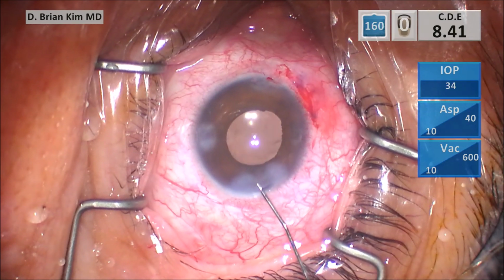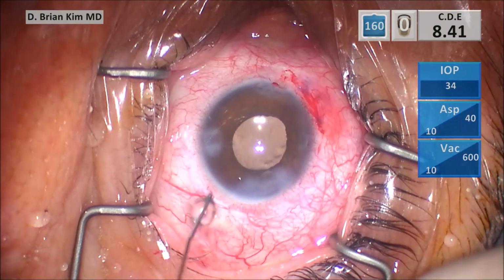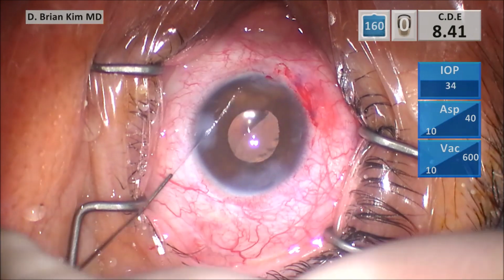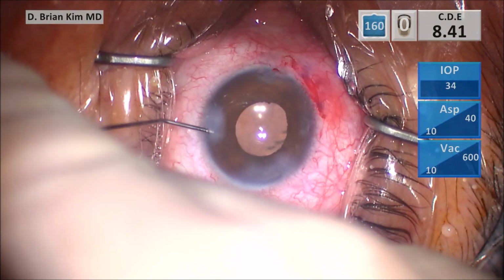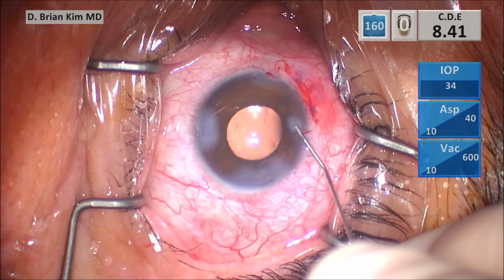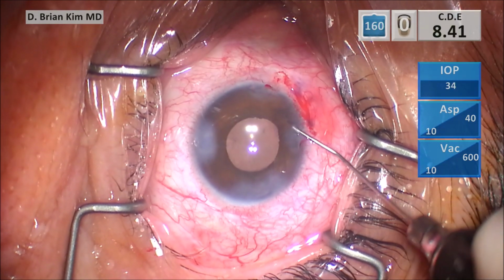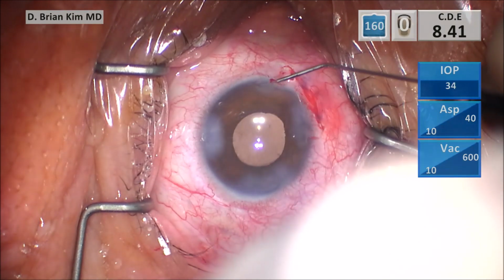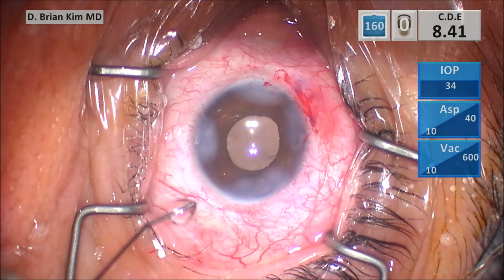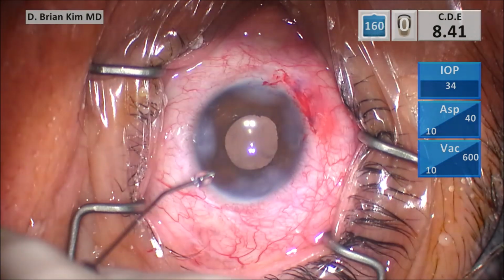And this patient has a fixed iris. You saw that I retracted the iris a little bit. I pulled the iris out a little bit. You saw that as I was doing I/A, I used microforceps to pull on the pupillary edge. And I did that for two reasons. I wanted to make the pupil rounder, but also in case there was some retraction of the suture outside the sclerotomy, I wanted to be able to apply some internal tension to pull some slack out of the suture and pull that suture inside the eye, which is, of course, safer, to have more redundant suture in the eye than outside the eye.